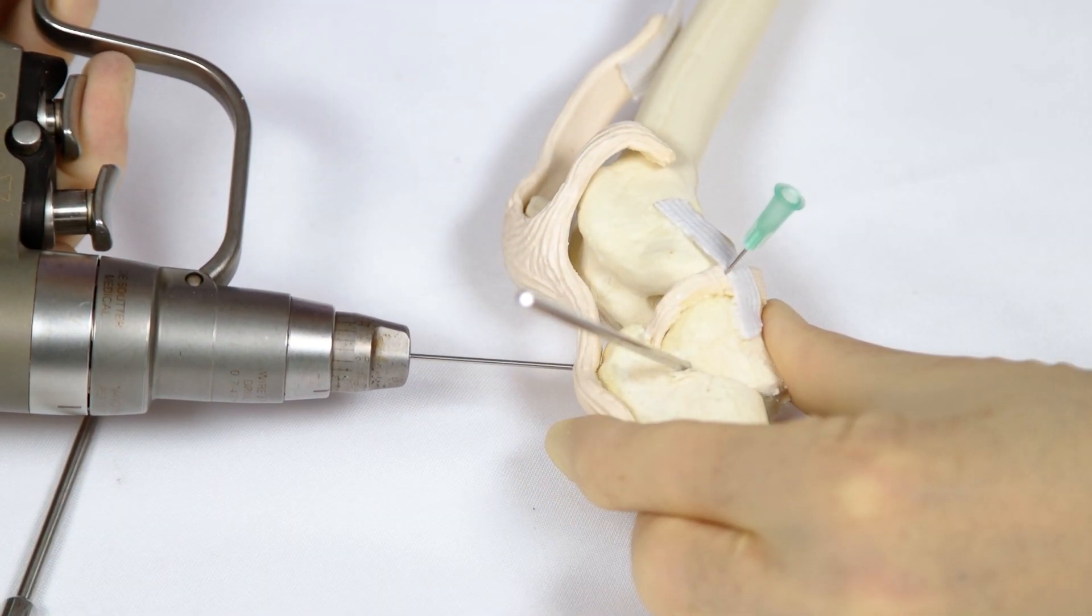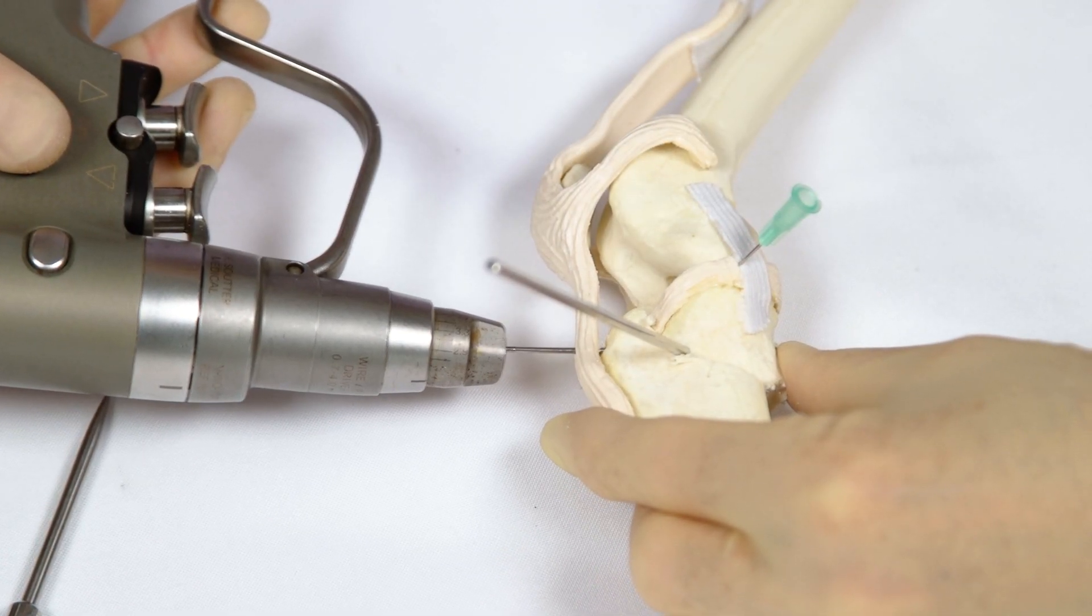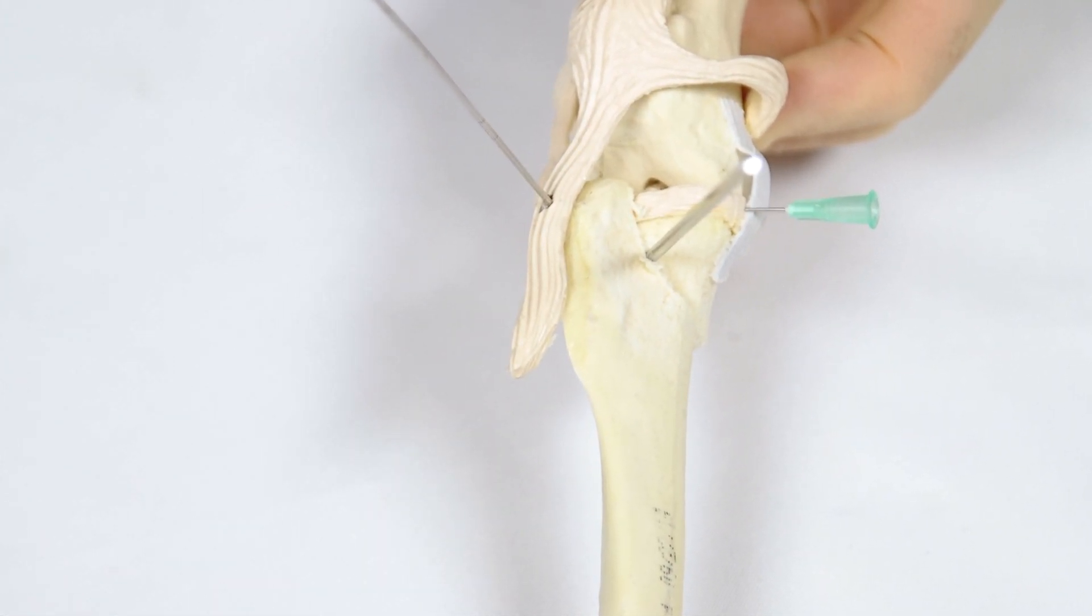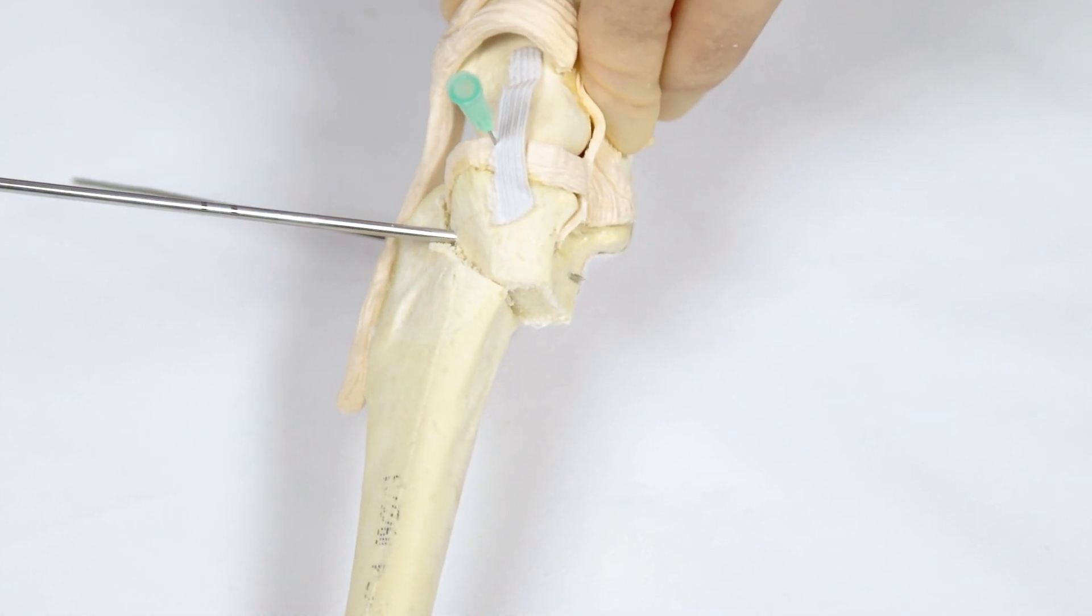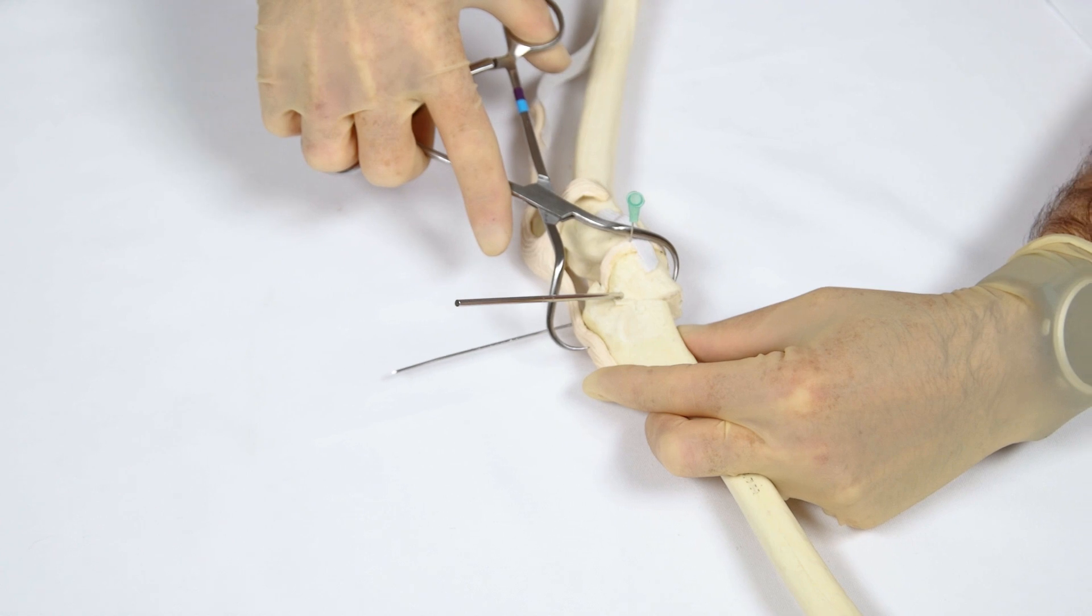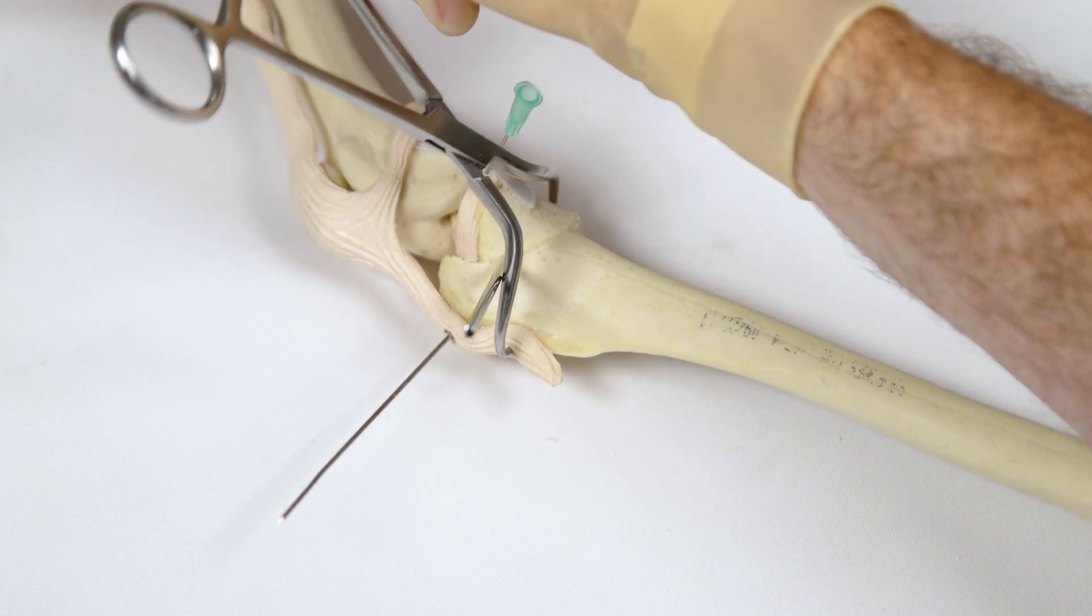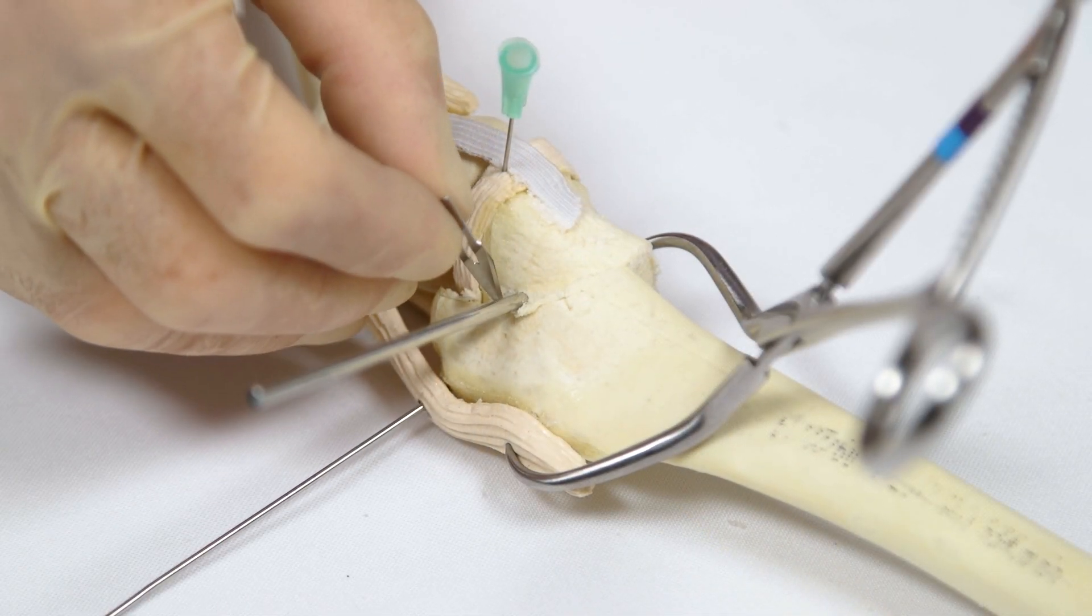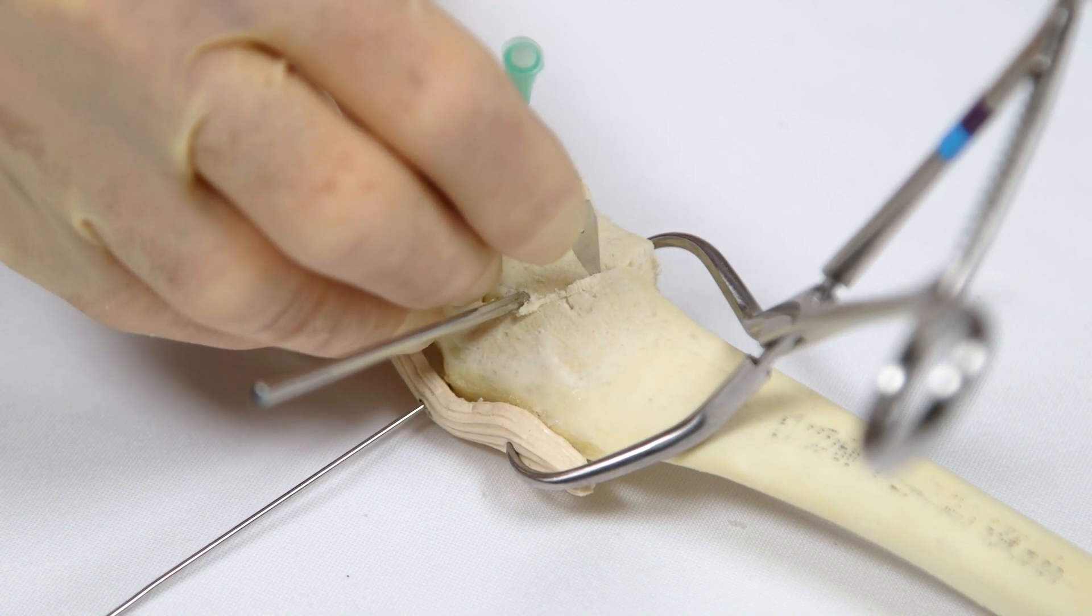A K-wire is placed to stabilize the rotated tibial plateau. The K-wire is inserted into the tibial tuberosity just proximal to the most distal insertion point of the patellar ligament. It is driven cranial to caudal, with the tip just exiting the bone of the caudal tibial cortex. The osteotomy is then compressed cranial to caudal using a large pair of bone-holding forceps. These are placed cranially on the tibial tuberosity and caudally in the caudal tibial plateau. There should be no gap at the osteotomy. A number 11 blade can be used to check that there is no gap.